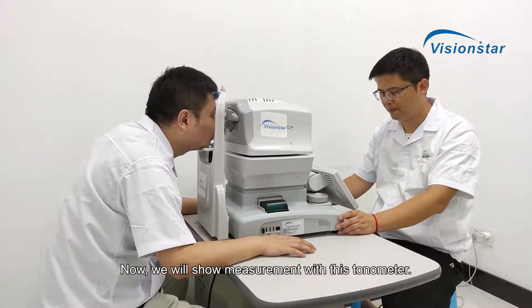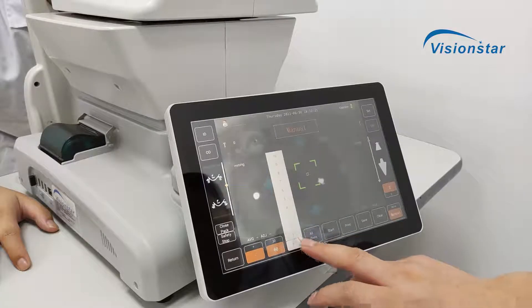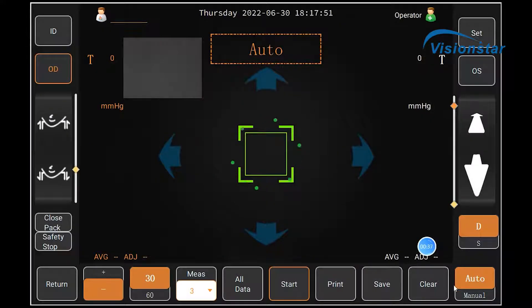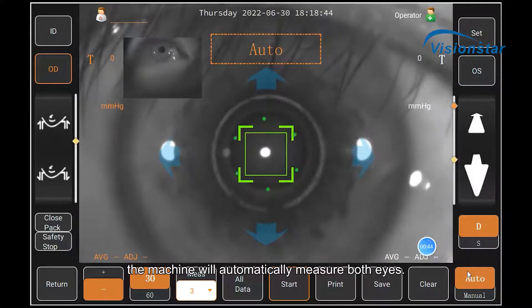Now we will show measurement with this tonometer. You only need to select auto mode and click start. The machine will automatically measure both eyes.